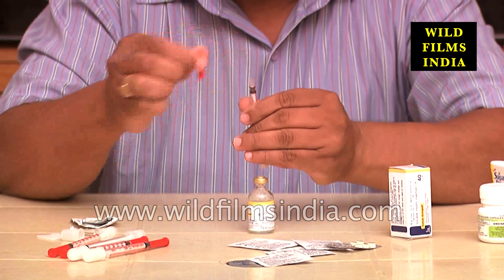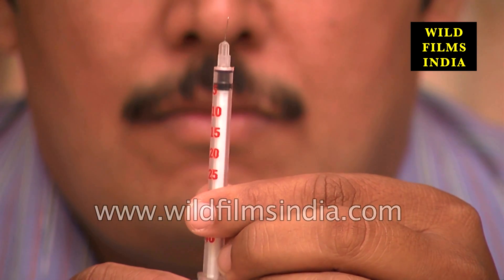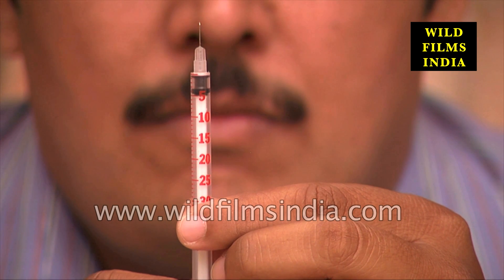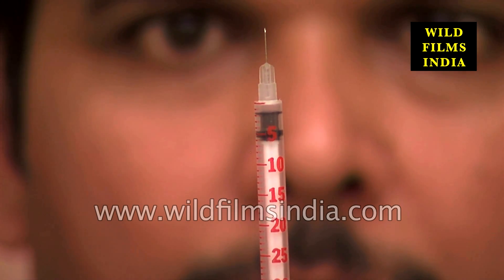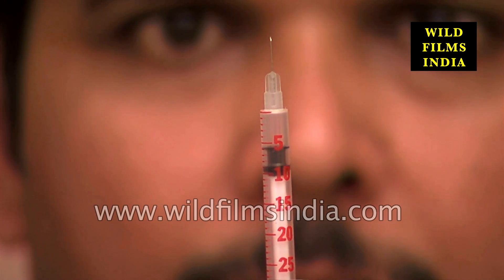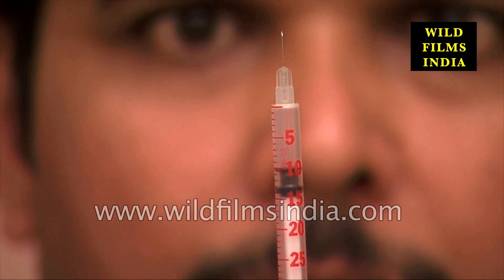Safely remove the cover of the needle of the syringe. Take care not to touch the needle on any surface other than the vial of insulin and your skin. Pull the plunger on the syringe back to the number corresponding to the desired units of insulin to be taken. For instance, if you want to inject 10 units of insulin, draw the plunger back so that the end of the plunger is at the line corresponding to 10 units.